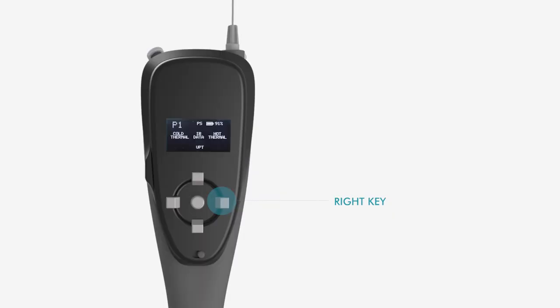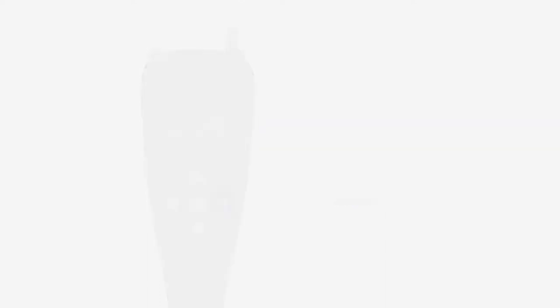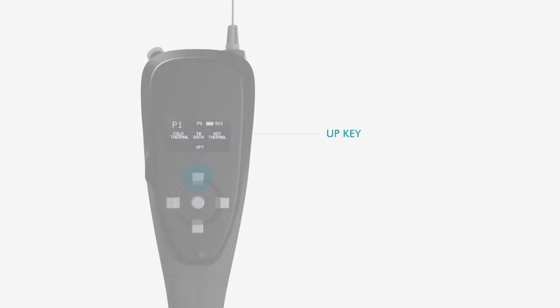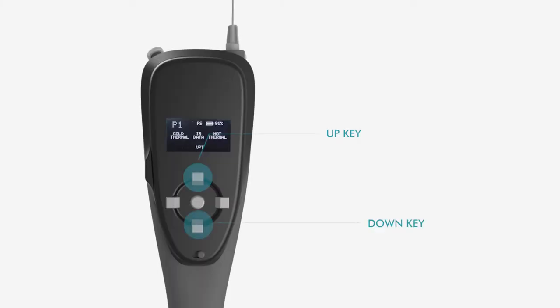Press right key to select Hot Sensation Test. Set temperature — by default, this will be the ambient temperature at the beginning. Press up key to increase and down key to reduce the temperature of the hot probe.